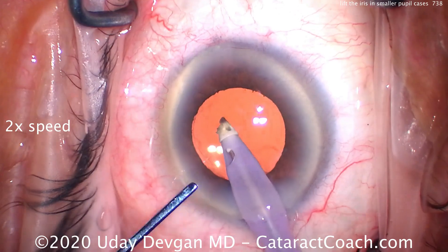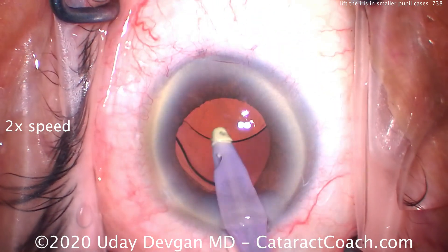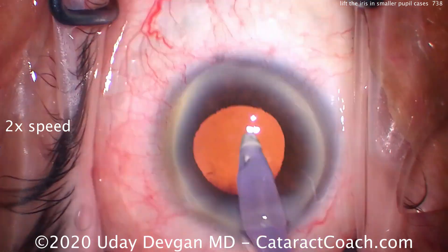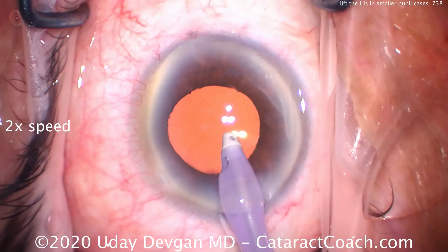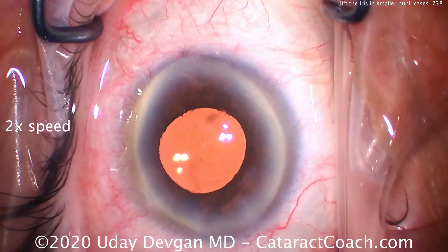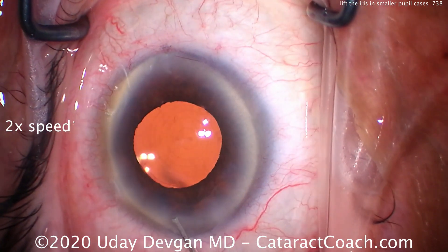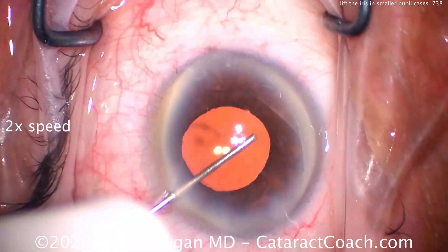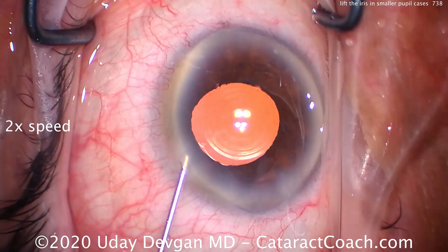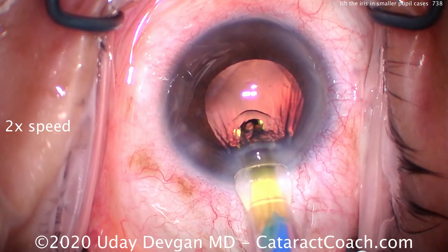Now we can get it out with the IA probe, and if we need to, use the spatula to push it down the port. We'll finish up the case going behind the IOL to remove the viscoelastic, and the rest of the case will proceed normally. So it's very important that you check carefully underneath the iris in cases like this. Now, these aren't tiny pupils — we didn't need to use iris hooks or a pupil expansion ring — but the pupils are small enough that they block a lot of our view.